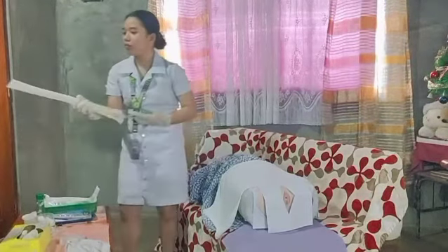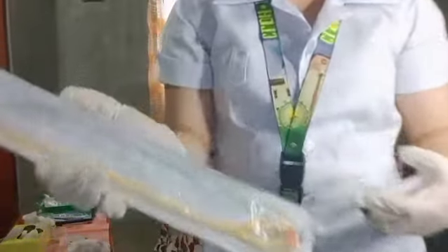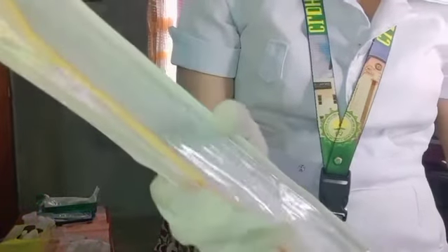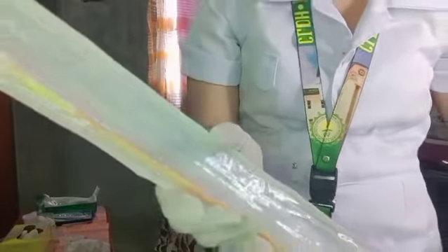Papakita ko lang kung paano siya nag-ano. So, lumalobo naman siya. Ayan. Okay.